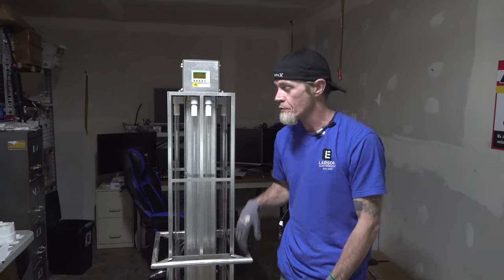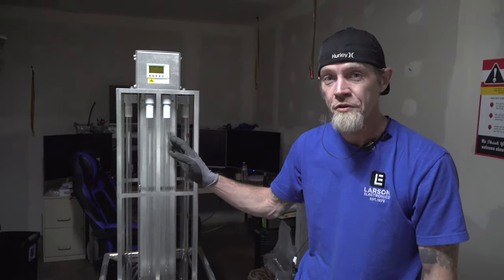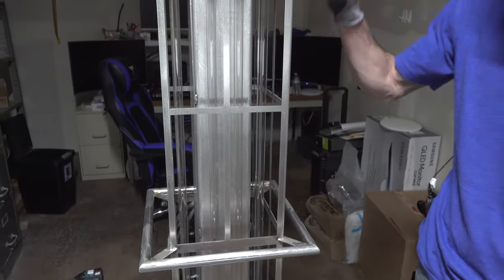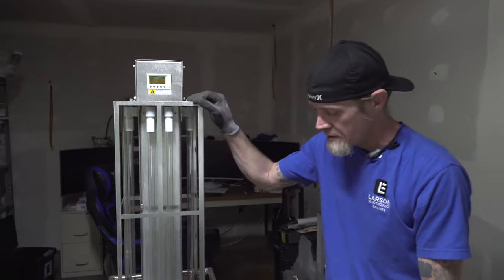Today we'll be demonstrating how to remove and exchange the bulbs in your UVC sanitation cart. This particular model is a 48 inch UVC cart.